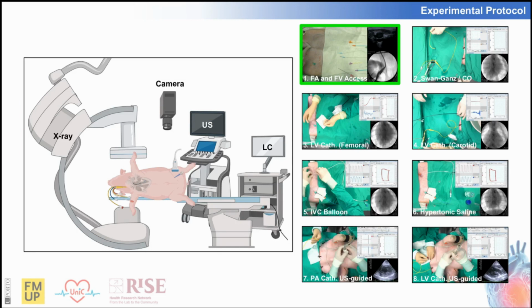So coming into our demonstration per se, we've prepared a set of videos that attempt to demonstrate different procedures. On the left, you have a scheme of our preparation and of the images you will see. All the procedures will have an overview image of the catheter manipulation, and then in parallel, you'll have either the X-ray, ultrasound, or a recording of LabChart. So first, we'll take a look at obtaining the vascular accesses.